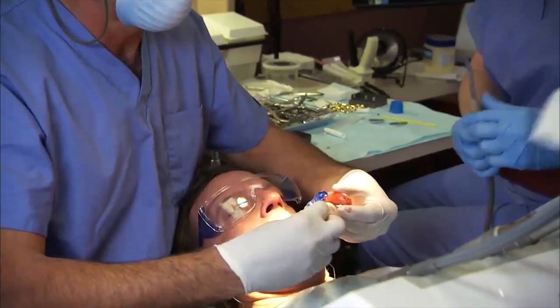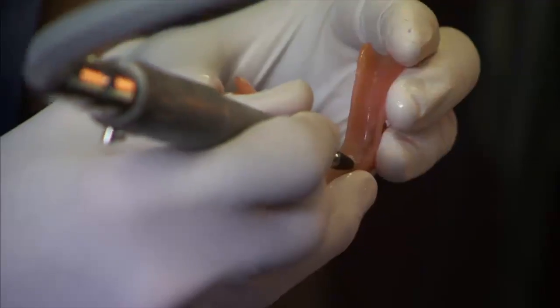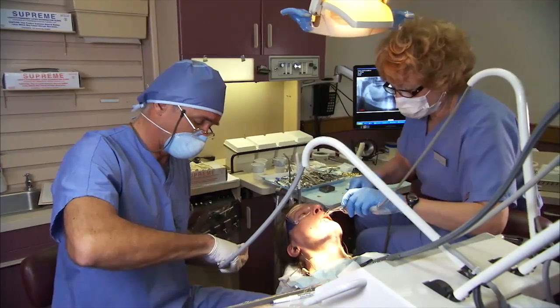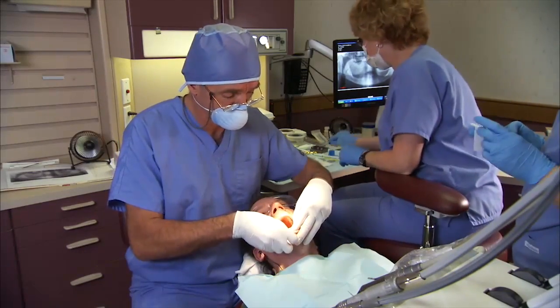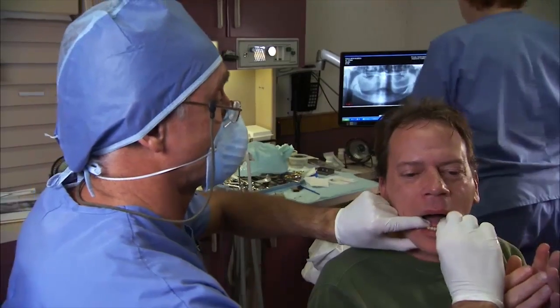Remove the denture and block-out shims. Trim, fill, and polish the tissue contact surfaces to achieve a comfortable, firm fit. After final fitting, instruct the patient to leave the denture in place for 48 hours to prevent tissue overgrowth on the abutments.